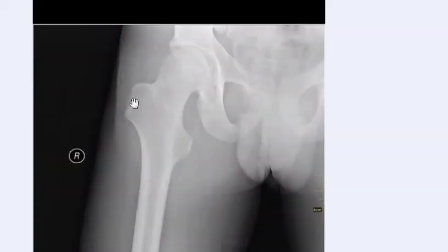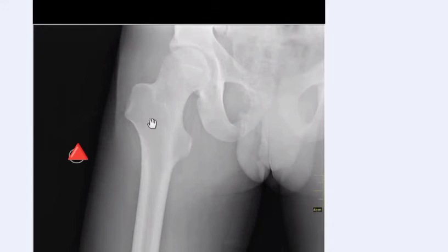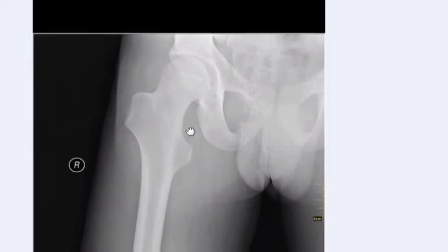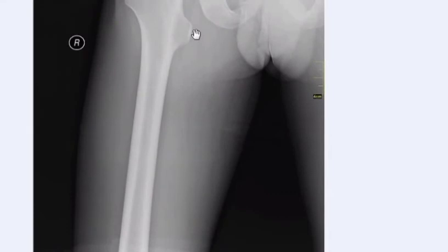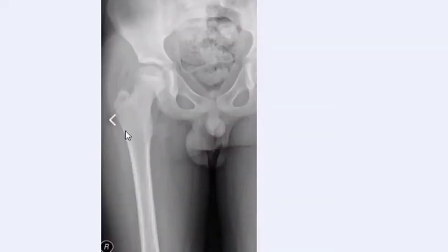Looking at this next X-ray: the head is there, the greater trochanter is there, and the lesser trochanter is also there. The head appears at one year, greater trochanter at four years, lesser trochanter at 14 years - meaning the child has reached 14 years of age. All of them appear to be completely fused with no gap at all, so the child must be 17 to 18 years of age. If we also see the distal femur fused, we could say 18 to 19 years, but the distal femur is not shown in this picture.